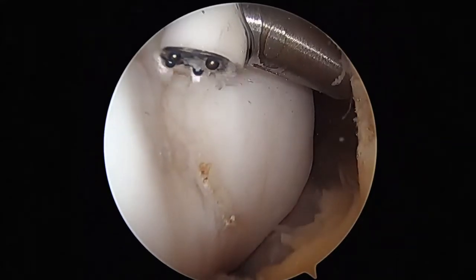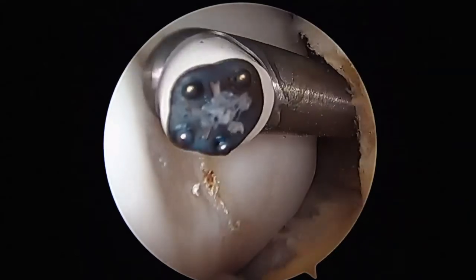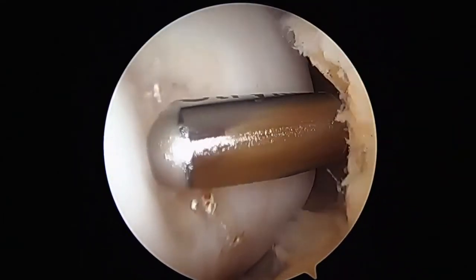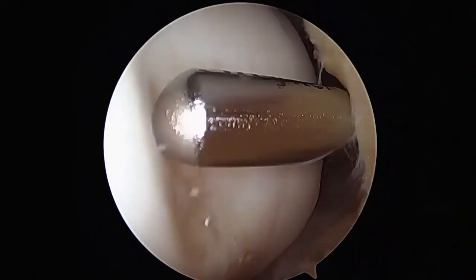Addressing this pathology with the surface energy wand allows chondral delamination and chondral pathology to be smoothly and quickly addressed, and once again with sequential changing of the wand to the chondratome to smooth and harden up the surface centrally and peripherally.